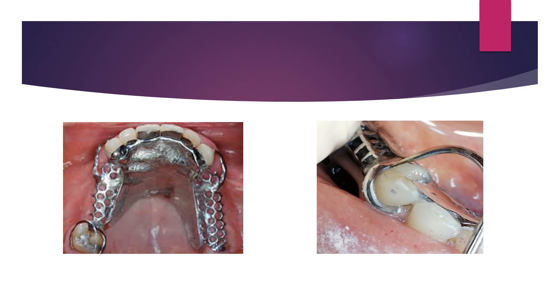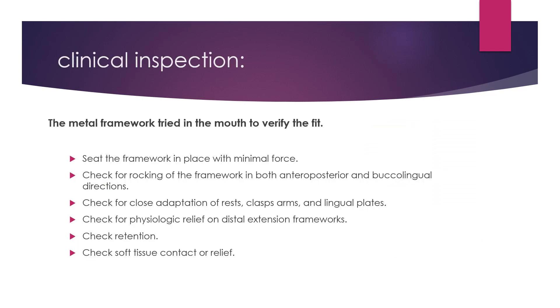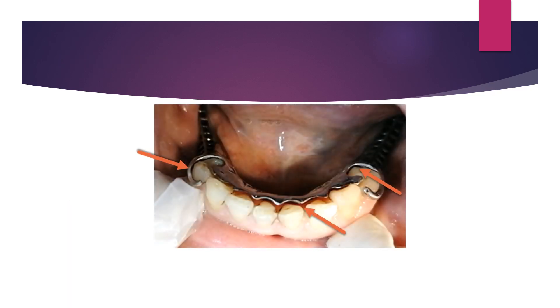There will be expected spaces under the framework in areas like under the free-end saddle part, as this will be compensated later with the altered cast. If the framework is not fully seated and there is a space between the major connector and the natural teeth, this is likely due to bubbles on the cast or abrasion of the cast in that area.